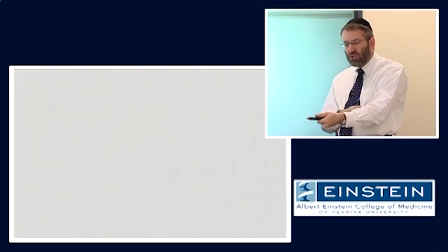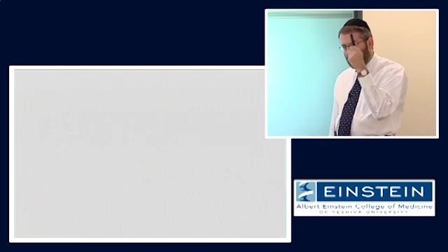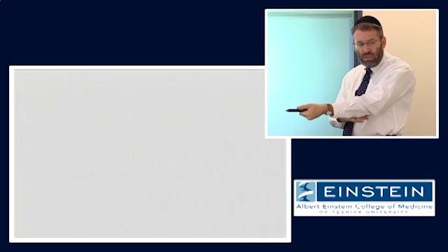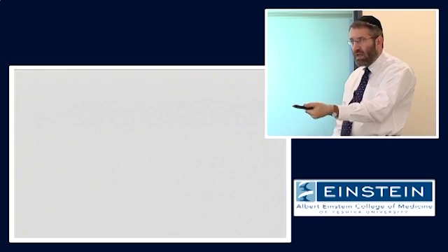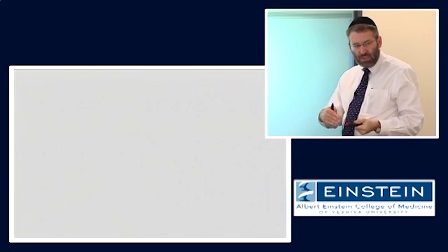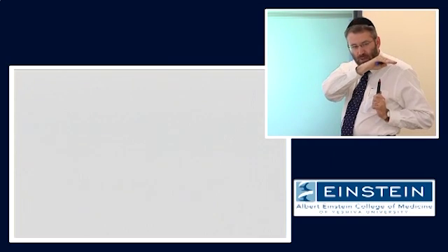Well, when the TR gets shorter, we knock it down the first time, so we're at rest. The patient goes in the scanner, lying there with their longitudinal magnetization. We tip it down to 90 degrees, and we now watch what happens. It starts to recover, and if our TR becomes shorter, before it gets back to where it started, we knock it down again. Now we have less transverse magnetization because less longitudinal magnetization had recovered to turn into transverse magnetization. It will start to recover, and when we get to that same TR, it won't even get back to where it got the second time around.